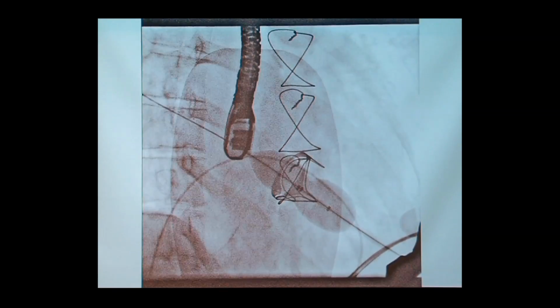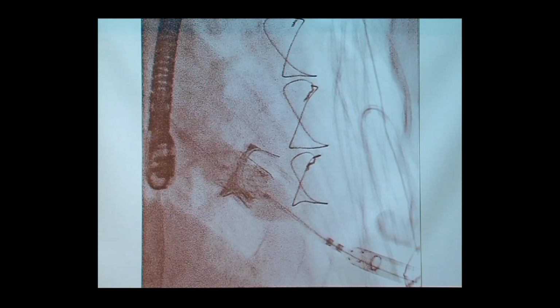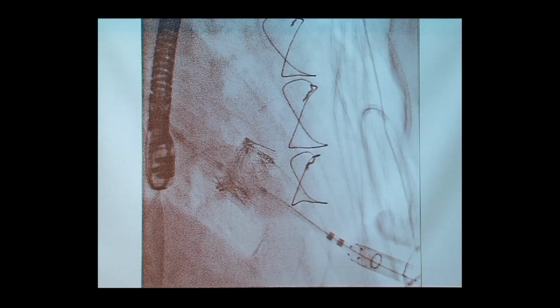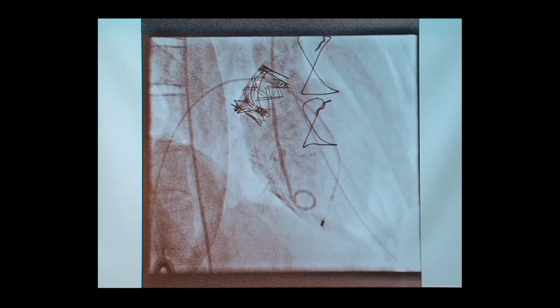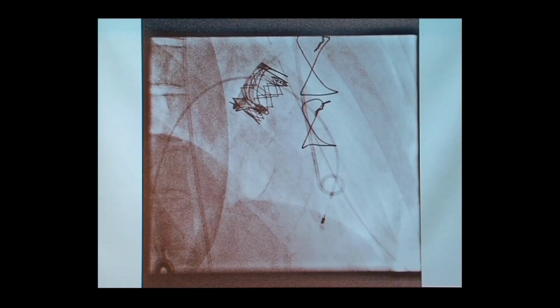So essentially, we went ahead and did what we call the transapical catheter valve-in-valve. So we've gone through the valve here, we put a balloon just to check the size of it, and here we are implanting a valve inside a tissue valve which has been implanted surgically. And as you can see, that's the angiogram and shows absolutely no leakage, a perfectly functioning valve. So all the blood is not going back into this atrial chamber, but it's going straight up into the aorta where it should be going. And she goes home on day 3 or day 4. So essentially, these are the sort of things which we can do now.